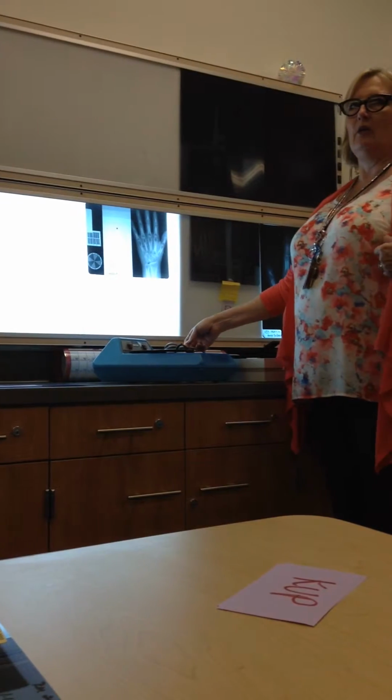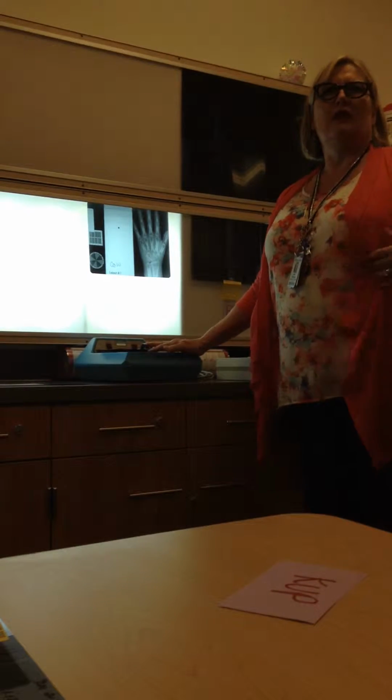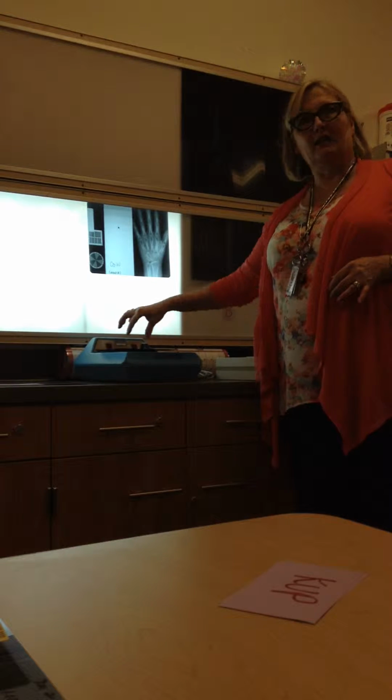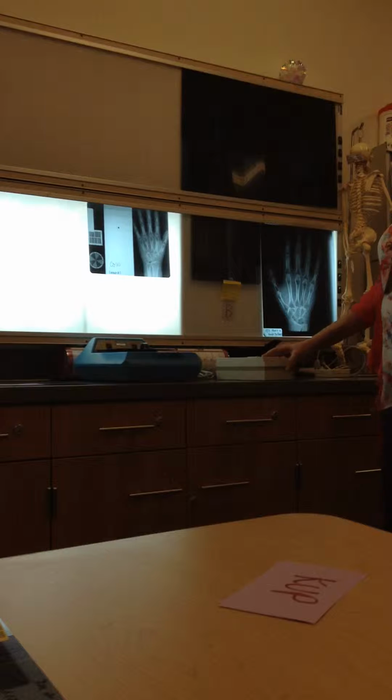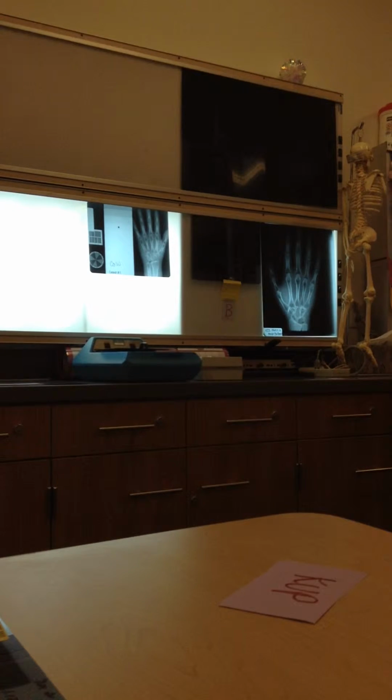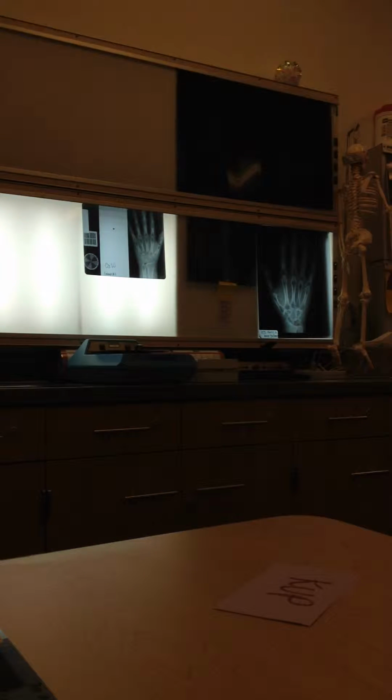And you measure the film. Okay, it's blue like this, but we've got to look and find it now. I don't know where. I hope it didn't get thrown away because it was broken. No, that's an ionization chamber. It looks exactly like this, but it has a bar right here that you put under the film light. Okay, so we have two sensitometers now. Oh, I bet it might be in Nina's office. Anyway, all right.